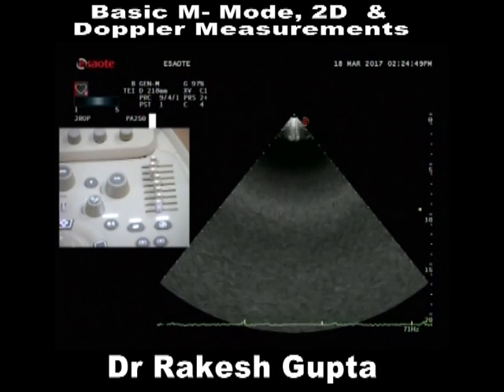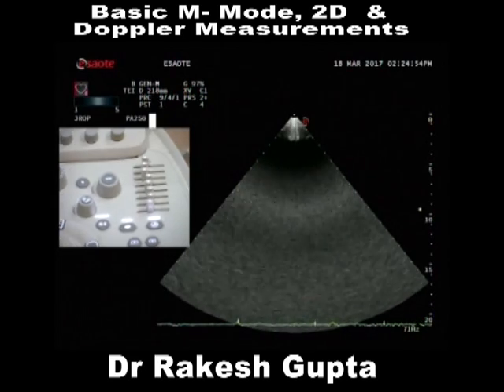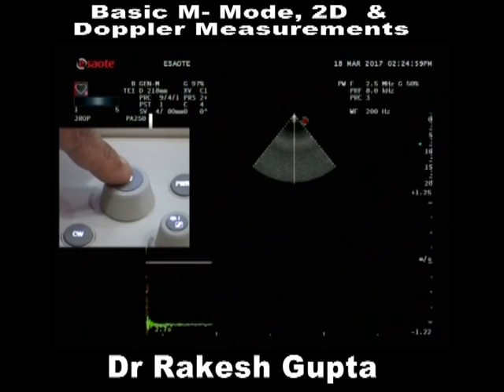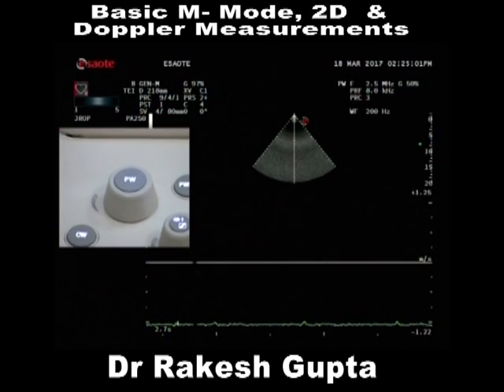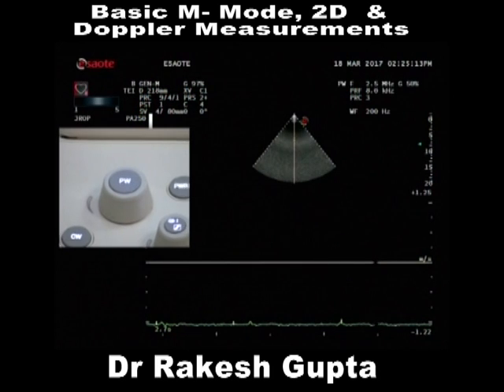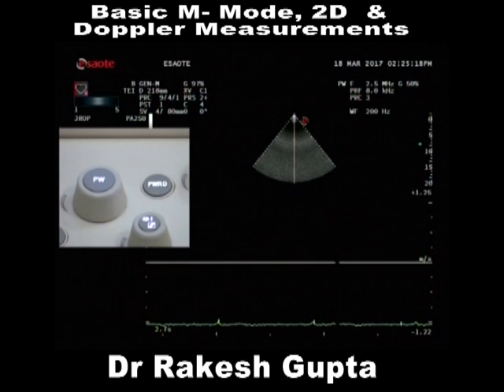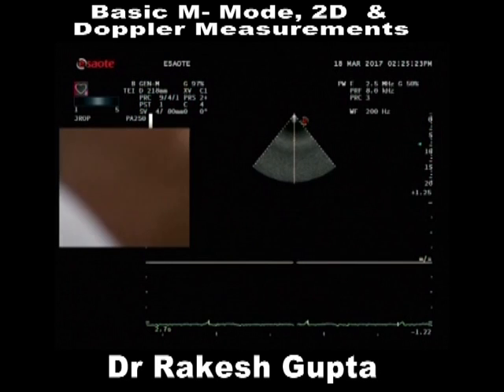We are clear about gains, we are clear about depth. Okay, next let's come down to pulse wave. Once I say pulse wave, what exactly has happened? Here is a baseline and here is a pulse. Pulse wave means it is measuring a velocity at this particular point. And how do you know on the screen where it's measuring a velocity? The machine tells you at what distance it's measuring a velocity.